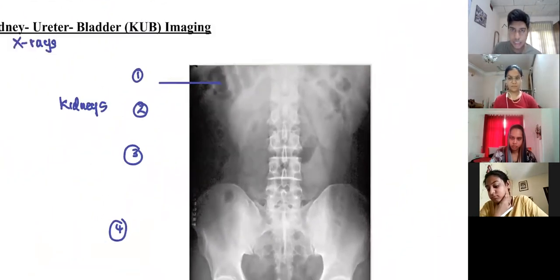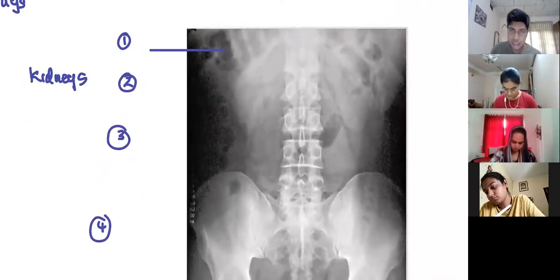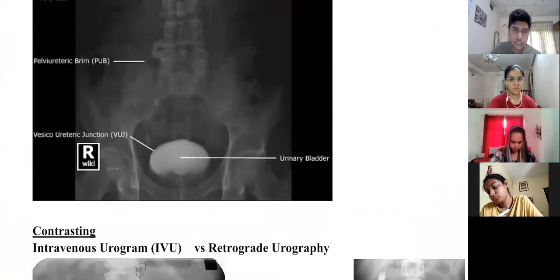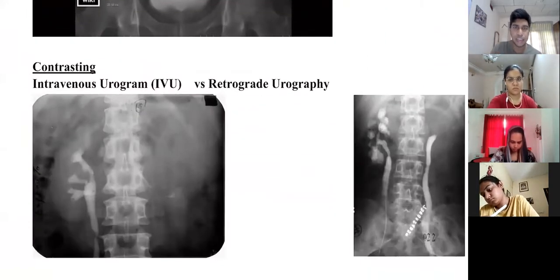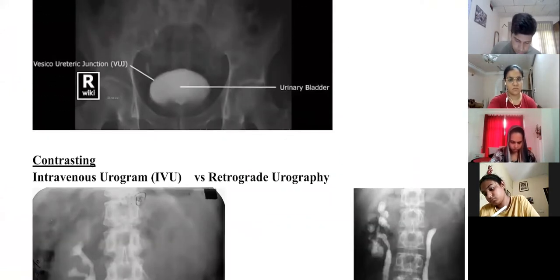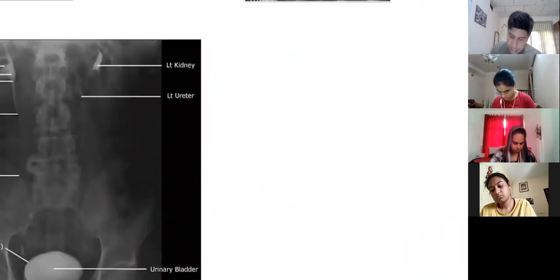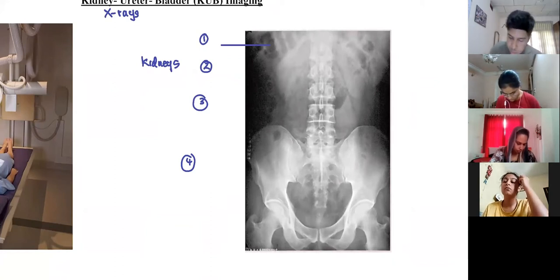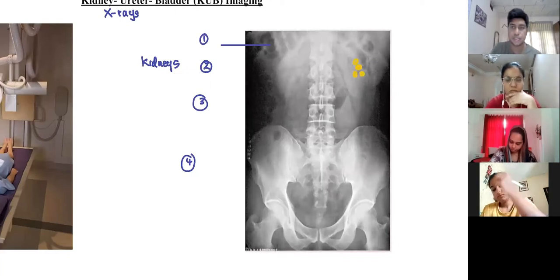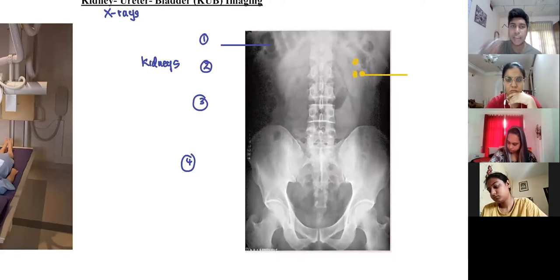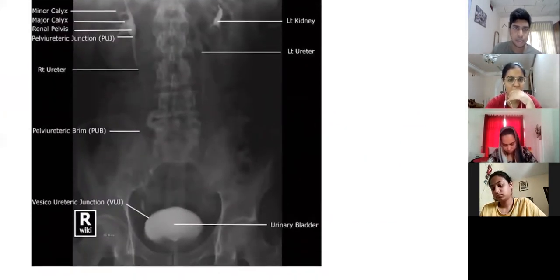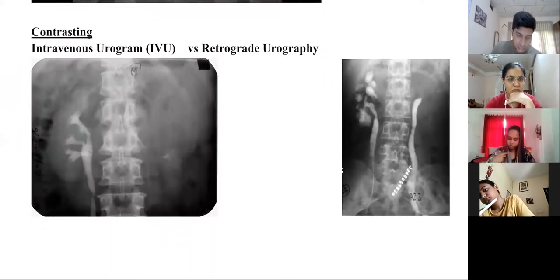What's the use of this imaging? You cannot see these because there's no pathology - this is a normal KUB image. To actually visualize these structures you need to use a contrast, some sort of a dye. However, if there was a calcium stone - a calculus - then this is the imaging modality of choice because you can see it very clearly.